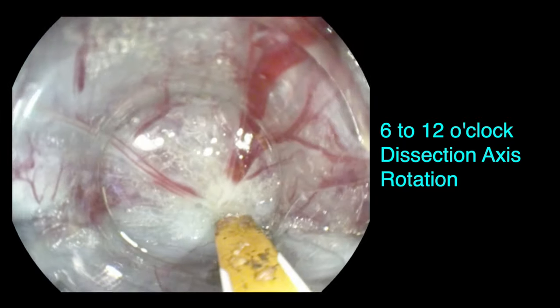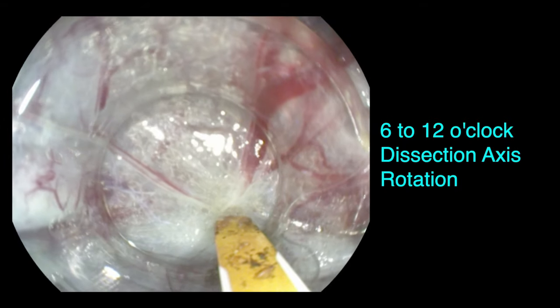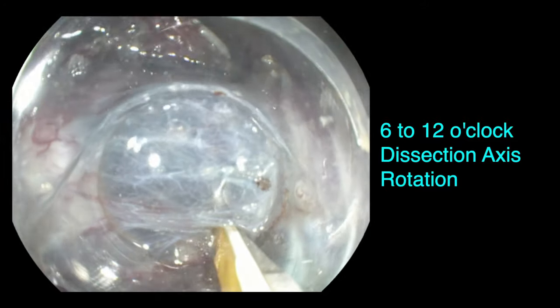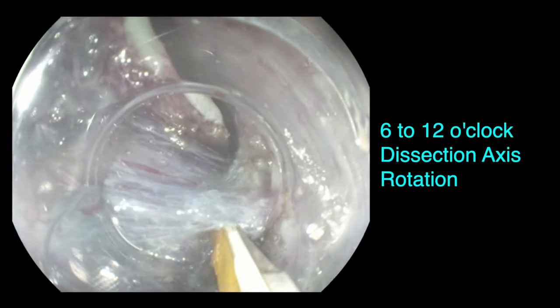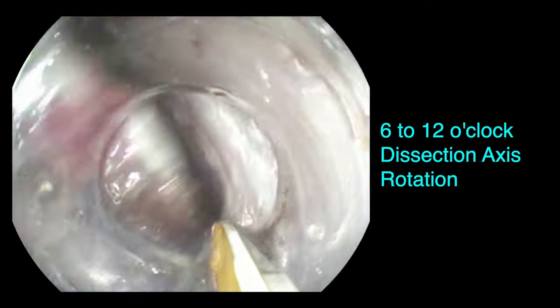Again, with precoagulation, you can see clearly after 2 or 3 seconds, there's a degradation of the collagen, and that causes a very efficient obliteration of the vessels. Again, the device can be used in different directions, from 6 to 12 to 3 to 9. This is on the last part of the lesion.